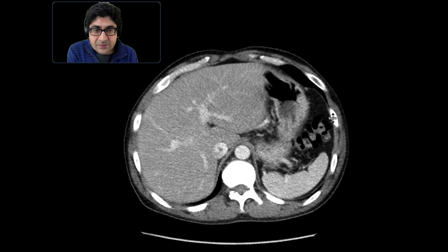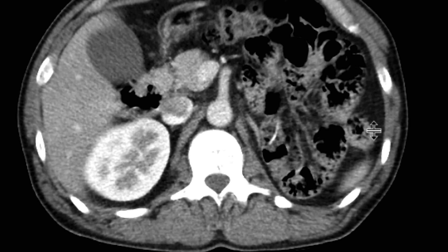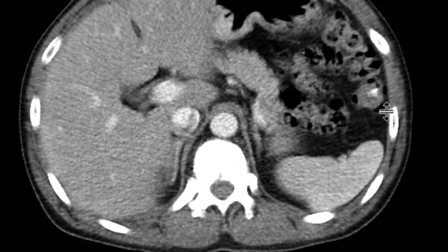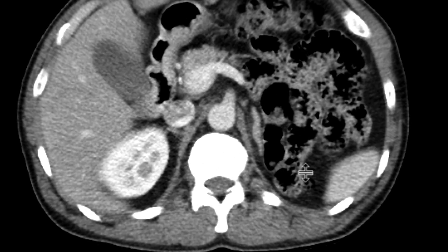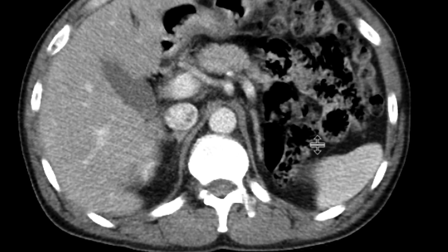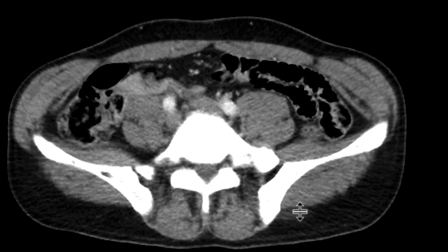The reasons we can tell this is twofold. First, look at the adrenal gland on the left side — notice the configuration. It has a very flattened shape, a sign called the 'lying down adrenal gland sign.' It looks very different from the right adrenal gland, which has medial and lateral limbs splayed out. When you see that flattened shape, it suggests the left kidney never rose up embryologically to occupy its normal space, so it's either absent or perhaps lower down in the pelvis. We don't see a kidney in the pelvis here, so it's likely an absent kidney.